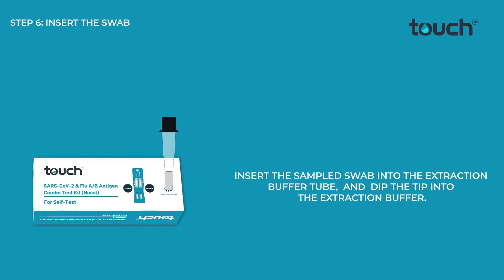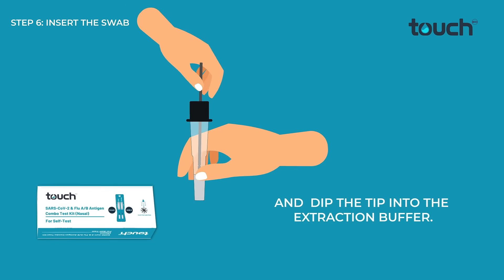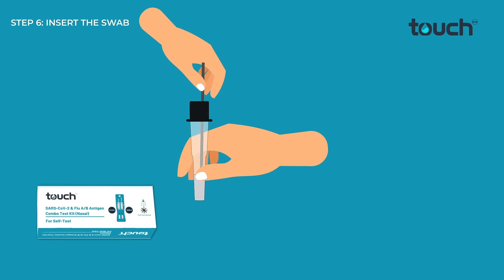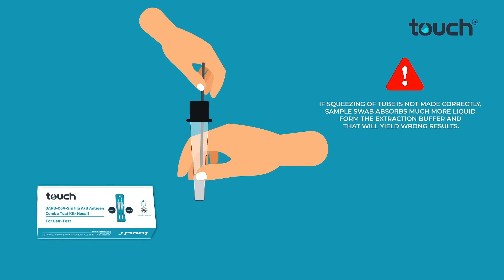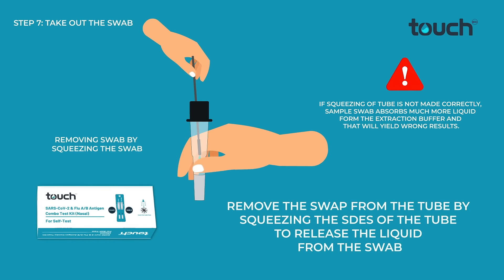Insert the sampled swab into the extraction buffer tube and dip the tip into the extraction buffer. Rotate the swab tip 10 times along the inner wall of the buffer tube. Squeeze the tip of the swab 5 times along the inner wall of the tube to keep as much liquid in the bottle as possible. Remove the swab from the tube by squeezing the sides of the tube to release the liquid from the swab.